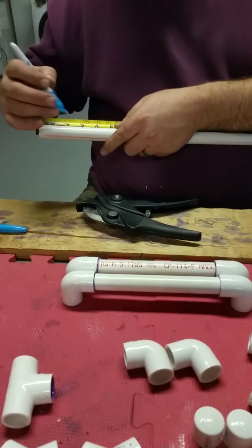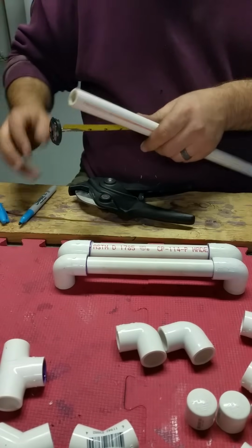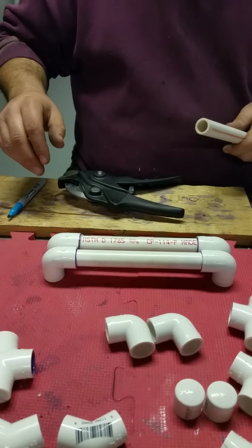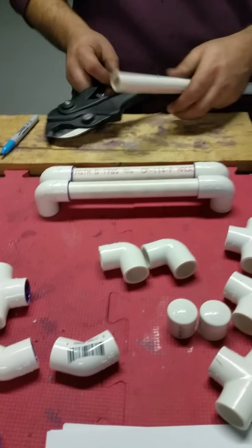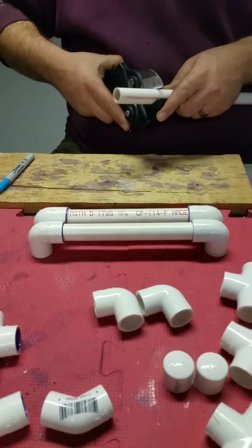Next, we're measuring the pieces to connect the back of the cart to the leg that will hold the axle and the wheel. We make these 2 3/4 inches long. You'll need 2 of them.